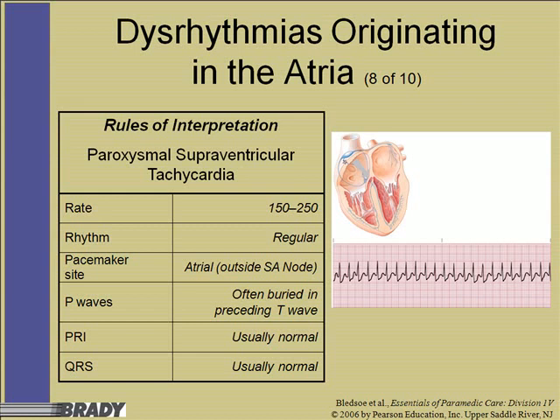The rhythm is very regular. You notice it's very, very predictable there across the screen. Pacemaker site is the atrial. It's outside of the SA node, so there's some place that's irritable. In this diagram here, it's not coming from the SA node. It's up high somewhere, but it's overriding that pacemaker. And the way I think of it is kind of like the throttle stuck, and it's just really on high. The engine is just really revving right now.